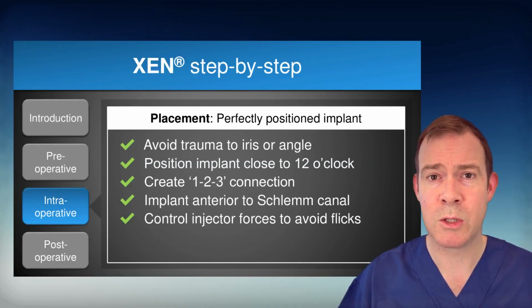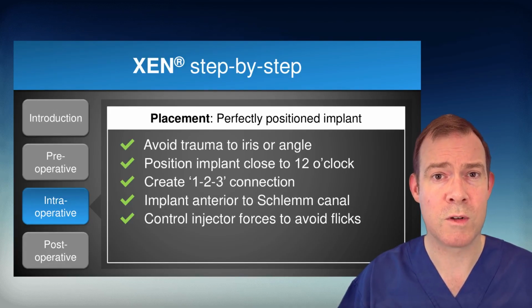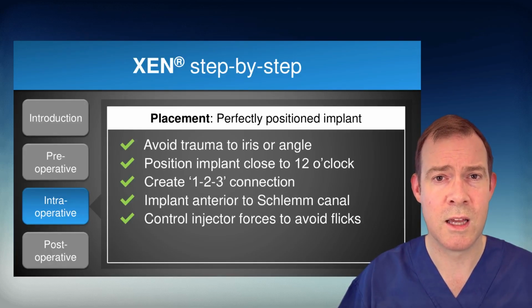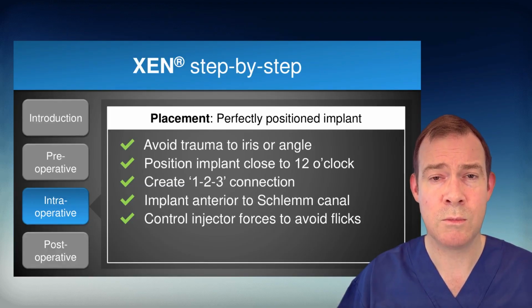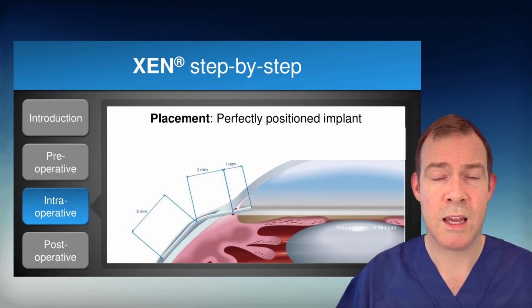When placing the XEN, it's critical to avoid trauma to the iris or angle. We want to position the XEN as close to 12 o'clock as possible, and creating a connection where there's 3 millimeters in the subconjunctival space, 2 millimeters in the sclera, and 1 millimeter in the anterior chamber. We want to avoid going through Schlemm's canal, which could cause blood reflux into the anterior chamber and lead to postoperative hyphema. When withdrawing the injector, release all lateral forces to minimize any flick motions. Here is a diagram showing the XEN positioned correctly.